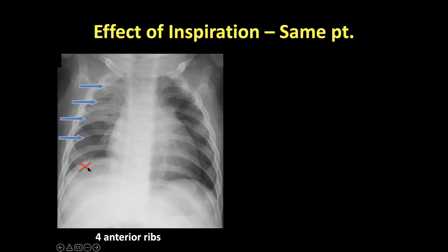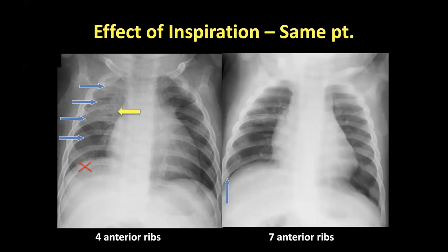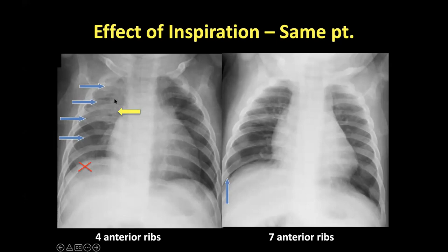This is actually a poorly-inspired X-ray. You might say, well why does it matter? Because I can see the pneumonia in the right upper lobe. Well, this is exactly the same patient who now has a better-inspired X-ray — we're seeing almost seven anterior ribs. You can see how less impressive this looks, and it was taken on the same day. Maybe on the poorly inspired one you'd be going 'this looks like bacterial pneumonia, the patient needs to be admitted,' whereas on the better one you'd go 'could this be more viral? Do we really need antibiotics?'